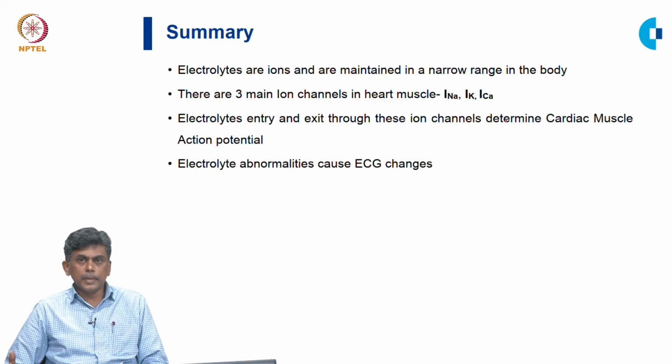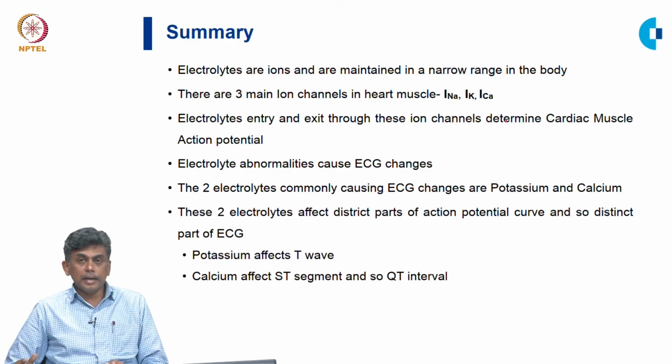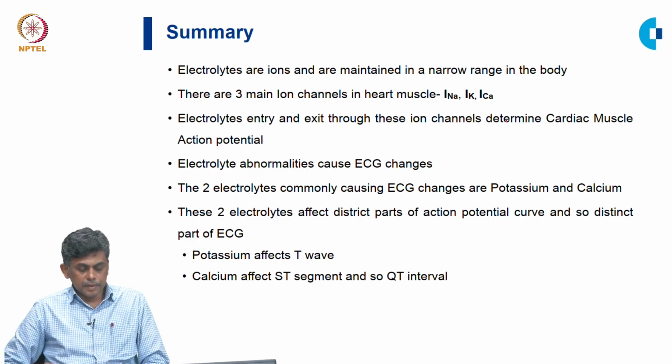So electrolyte abnormalities cause ECG changes. The two most important electrolytes are potassium and calcium.